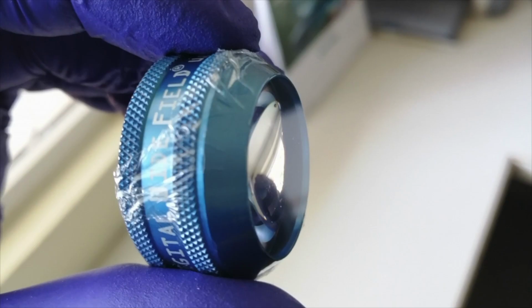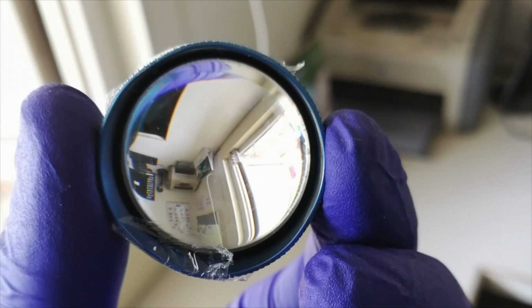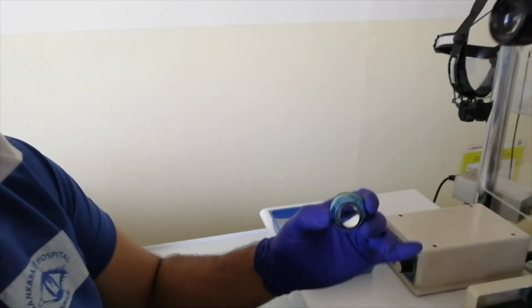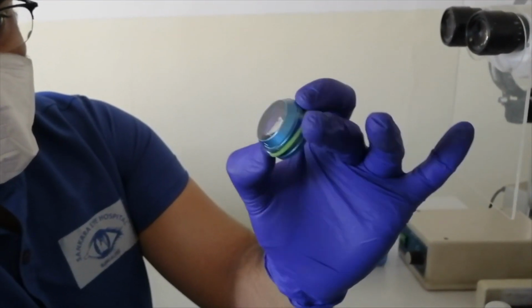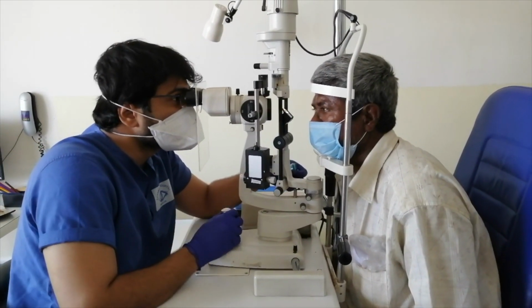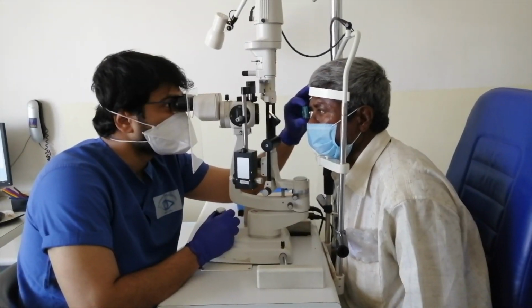As you can see, we have put a cling wrap on the lens surface facing the patient so that the front surface has a covering and the back surface is bare. The lens is kept in a box with a layer of dry tissue paper underneath. If required, an elastic band can also be used to further secure the covering. On proceeding with the fundus examination, the fundus details are made out quite clearly.